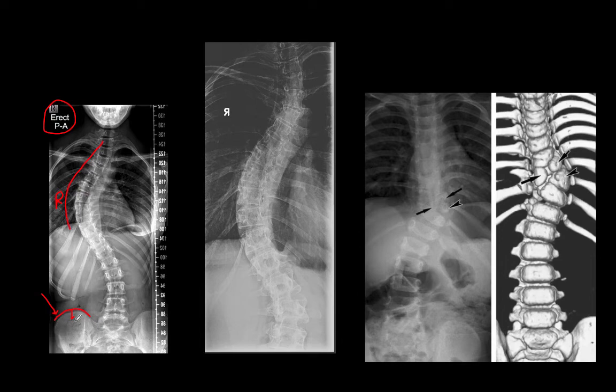And so, of course, there are two ways to measure scoliosis: the Risser-Ferguson, and then the actually preferred Cobb's method. Cobb's just takes the uppermost end plate and the lowermost end plate, extends them out into oblivion, and then we measure the angle occurring between them. Usually they'll drop a perpendicular and measure the acute angle.